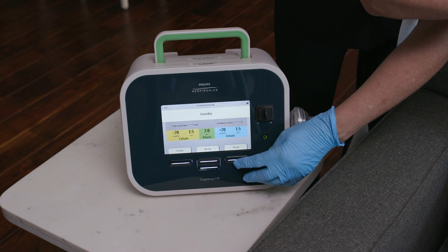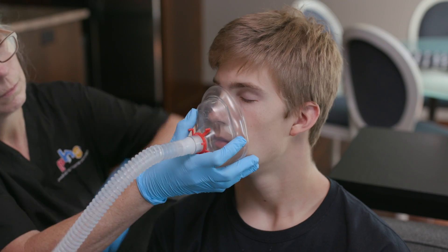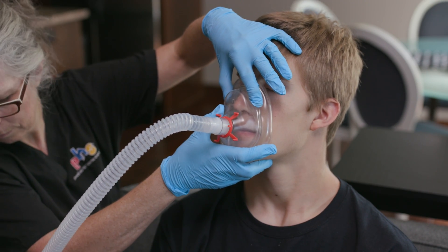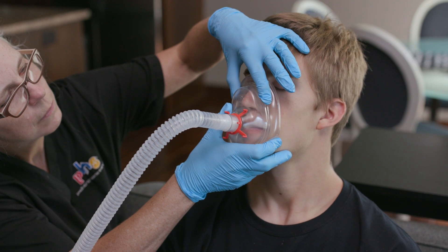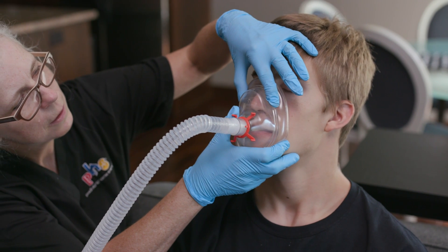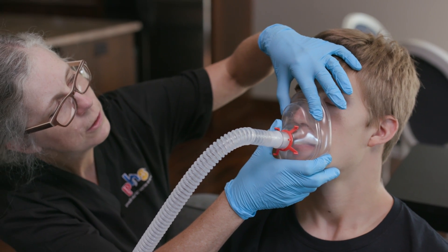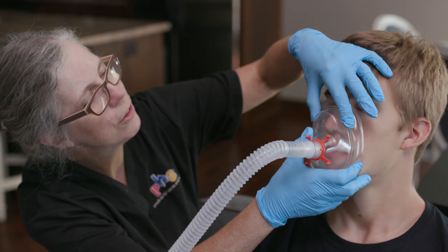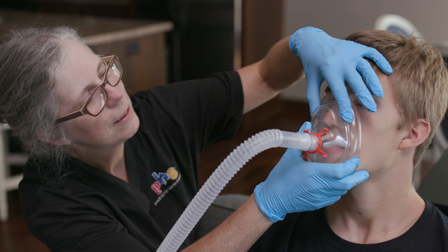Push the therapy or start button to start the session. Allow the device to give the prescribed number of inhalation and exhalation cycles, usually four to six. Monitor the patient's color, heart rate, and comfort level during the cycles. You may stop the therapy if the patient becomes uncomfortable, needs to cough, or needs to be suctioned.